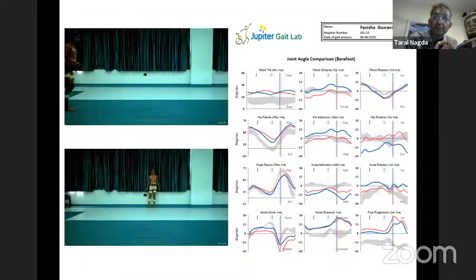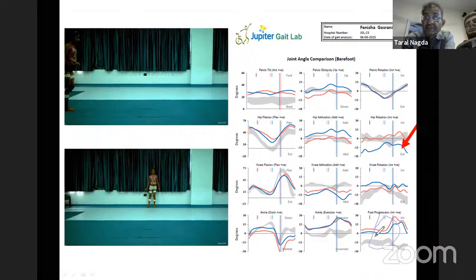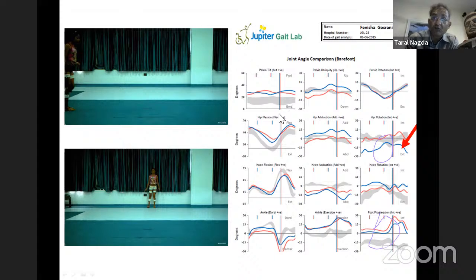Okay. So here is an example I want to give you. This is the child, and she is walking with a rotational issue. You can see that there is internal rotation as far as the foot progression angle is concerned. So I am showing here the foot progression angle which is internally rotated, and you can see that that has resulted in the hip being externally rotated. So the problem is not here in the hip joint, but actually it is in the tibial torsion.